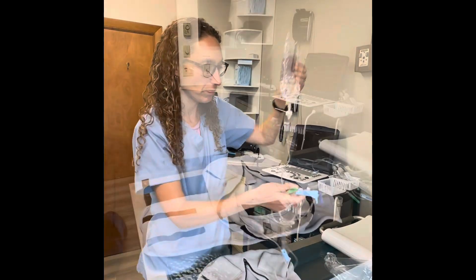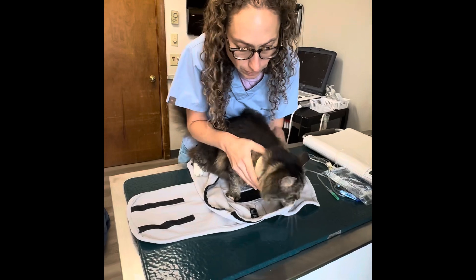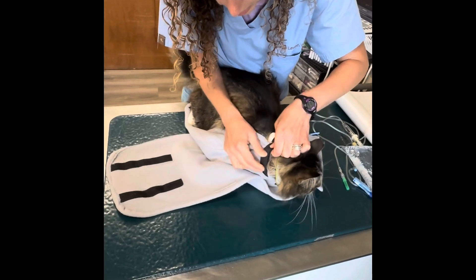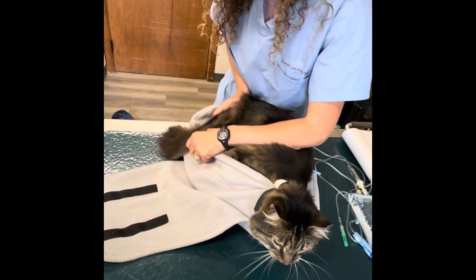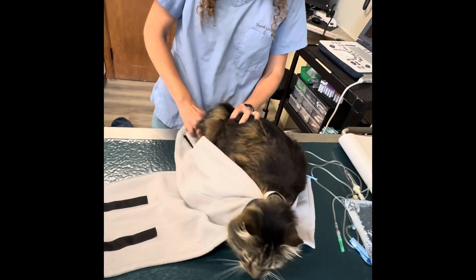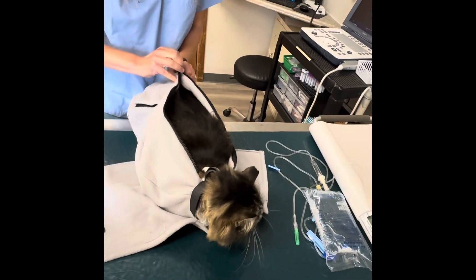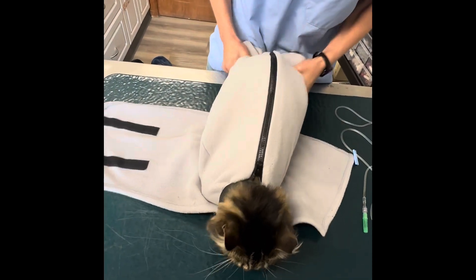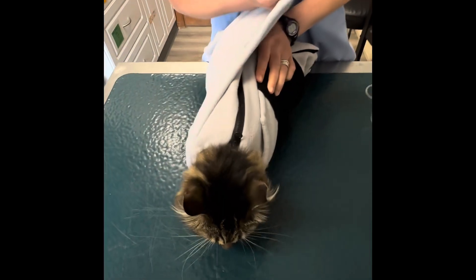So now I'm going to go get my patient. This is Piggy — I'm going to put him down. I'll reach for the velcro, get his neck velcroed first, nice and firmly. Then tuck in his hind legs and his tail. And then I'm going to get him straightened and push him a little bit forward.